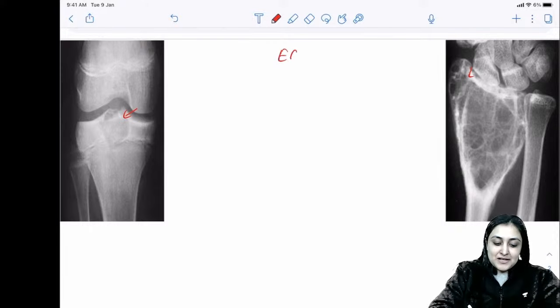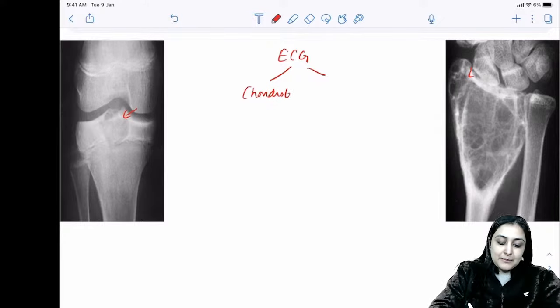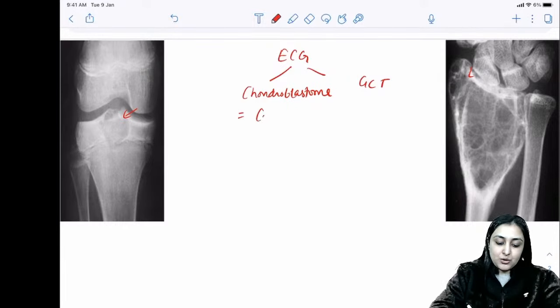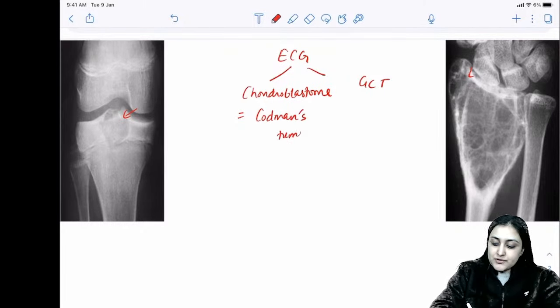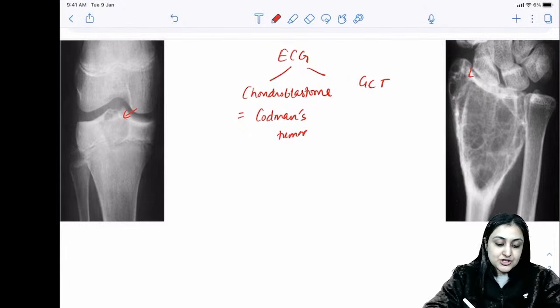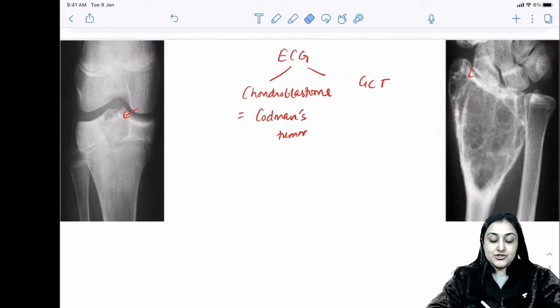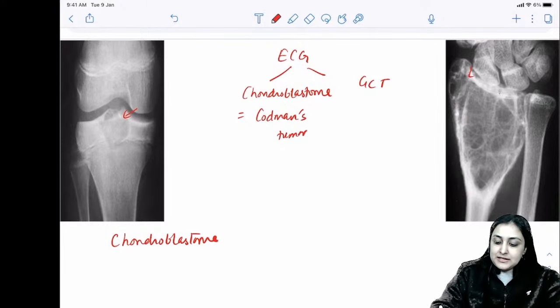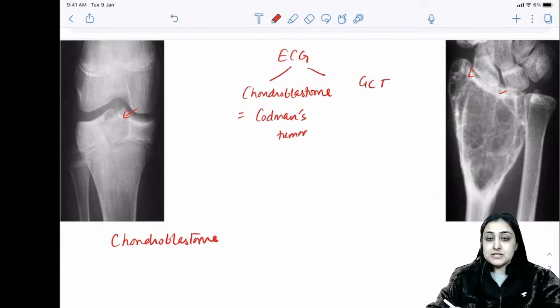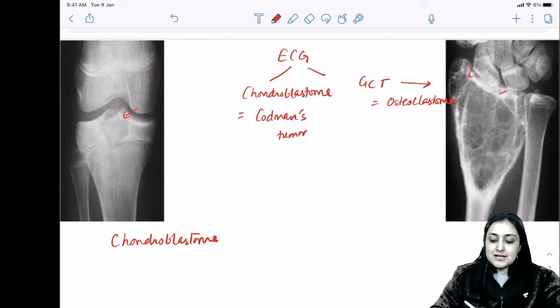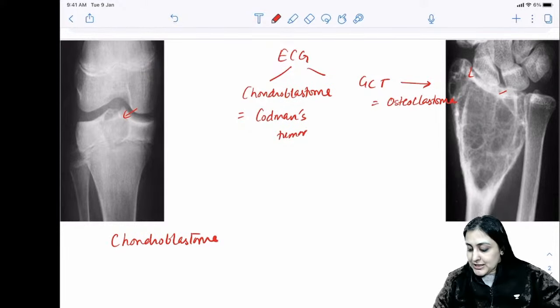Epiphyseal tumors — remember the mnemonic ECG. We have chondroblastoma and giant cell tumor. Chondroblastoma is also called Codman's tumor. On an X-ray with an unfused growth plate, this is a skeletally immature patient — that's chondroblastoma. On the other hand, when the growth plate is fused, particularly at the distal end of radius, this has to be giant cell tumor.